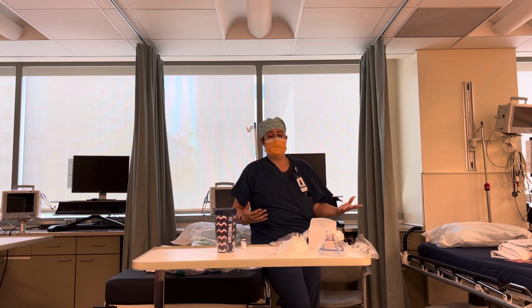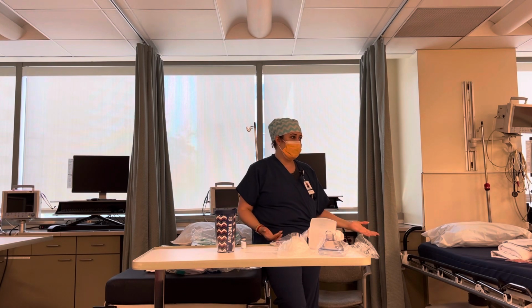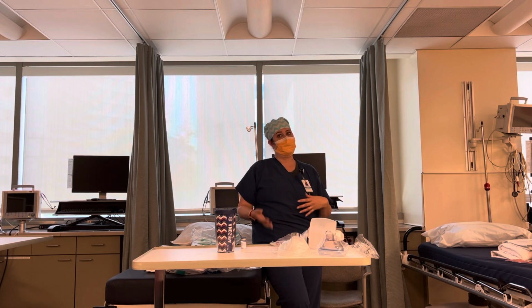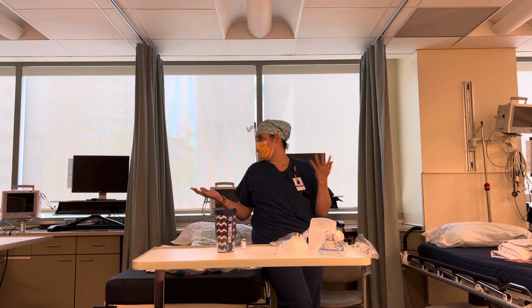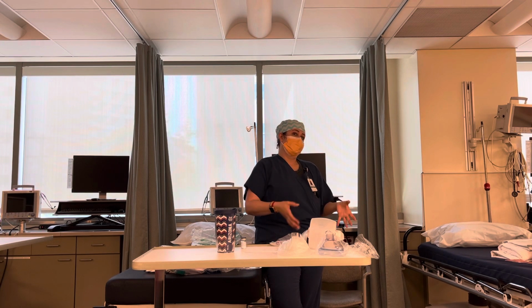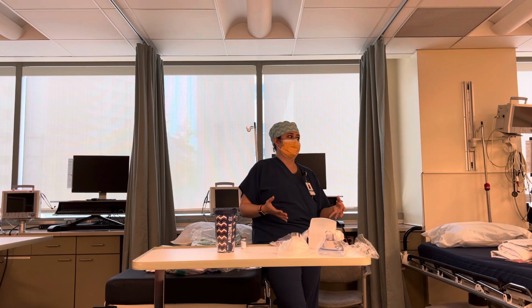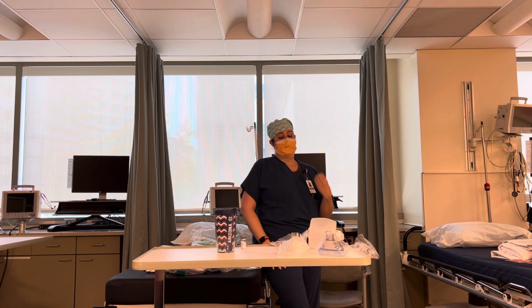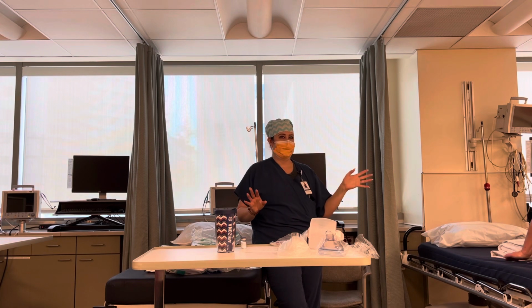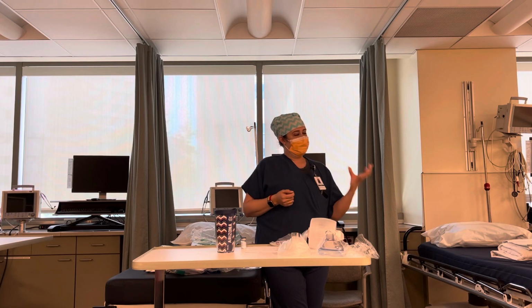So she noticed that. Obviously I wasn't in there the whole time, I came in later, but the patient starts desatting. Most of you have seen this happen, and we correct it, right? And so then her and Dr. Zia were probably like, okay, pull the scope out, I need to bag her up, get her sats up. You guys have seen this, most of you. And that doesn't always mean we're not gonna do the case. Sometimes we're able to give some positive pressure, break it, get their oxygen sats back up, and then try again. And in this case, this patient was very irritated. Her sats stayed in the 70s, maybe high 60s. When I walked in there, I think it was low 70s. Lips are blue, like she's not moving air. She still had the bite block in at that point.